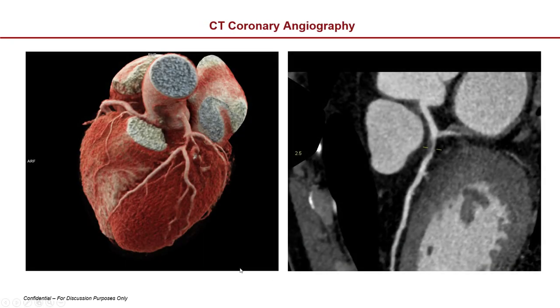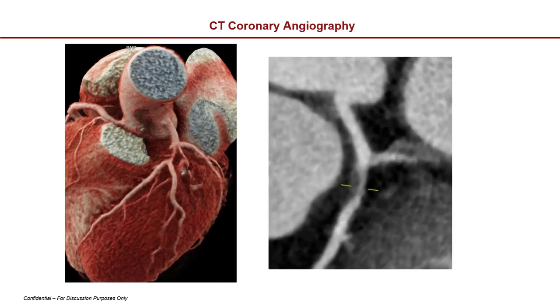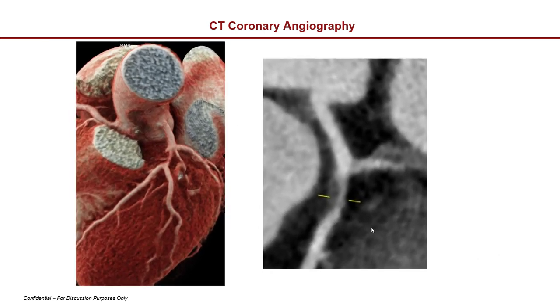Here's an example of a stenosis that is more than 50%. You can see it's very narrowed, and there is a soft plaque — a rupturable plaque that could potentially break off and subsequently block one of these diagonals distally, which could cause myocardial infarction, otherwise known as a heart attack.